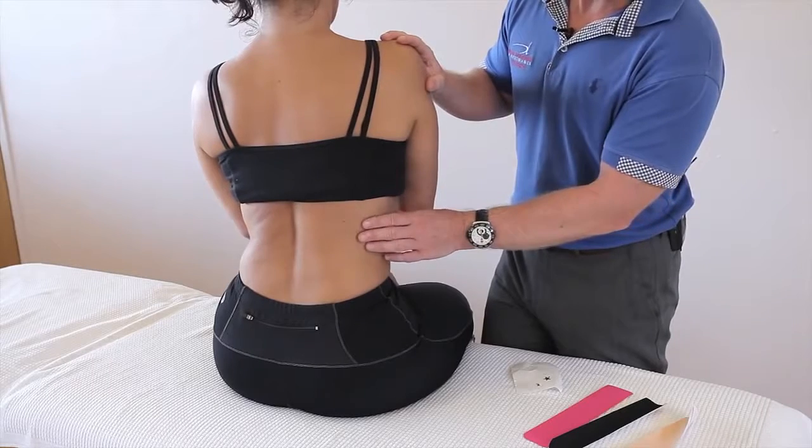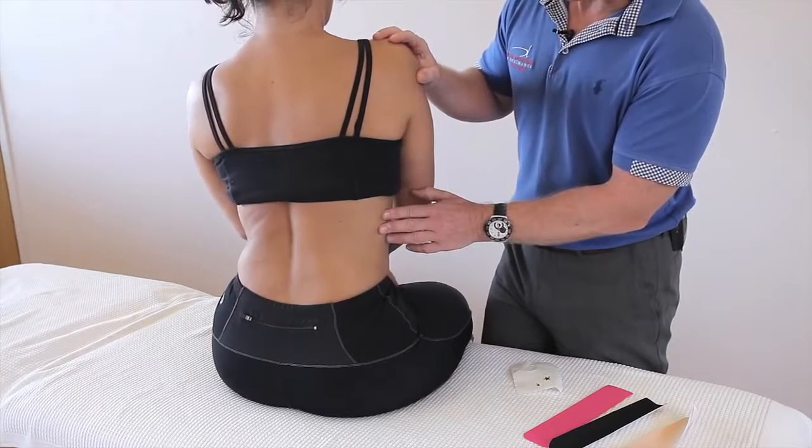If there's any trauma to the ribs, then kinesiology taping might help very well to offload the pain.